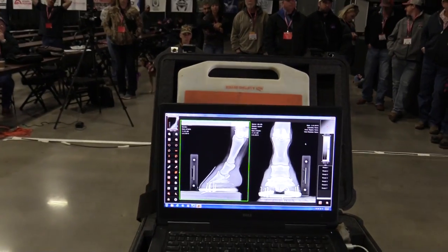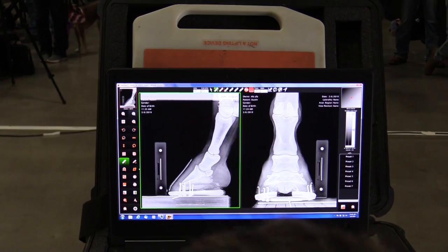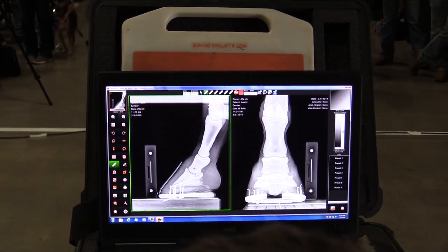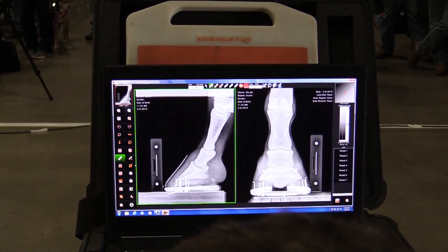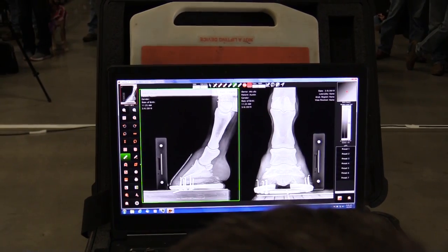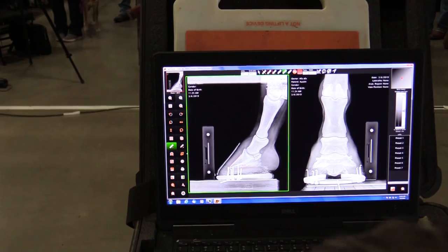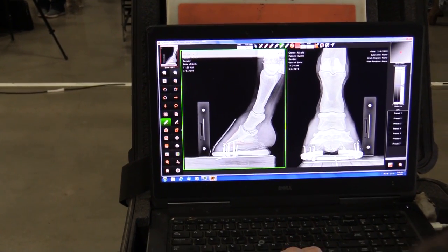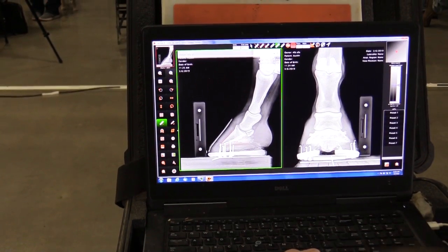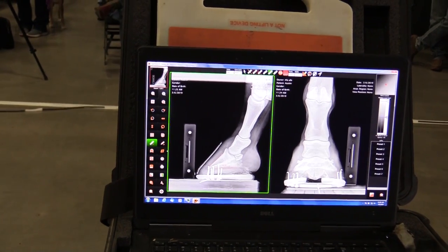So again, these x-rays look pretty similar to what we had a few months ago. If we go through here and take some measurements, we look at our bone angle. Bone angle is right around 42 degrees. If you have a healthy, well-balanced mechanical foot, that angle will be closer to 50 degrees. So your internal structure is creating a much higher, more compact foot.